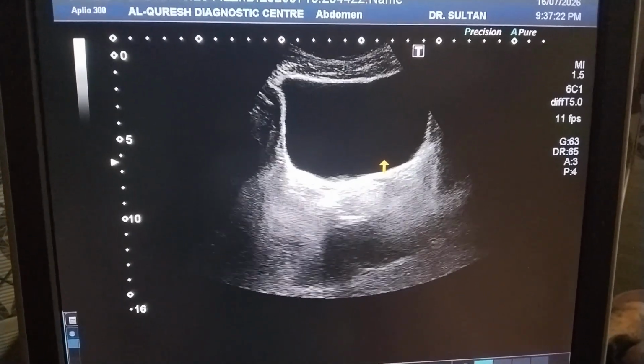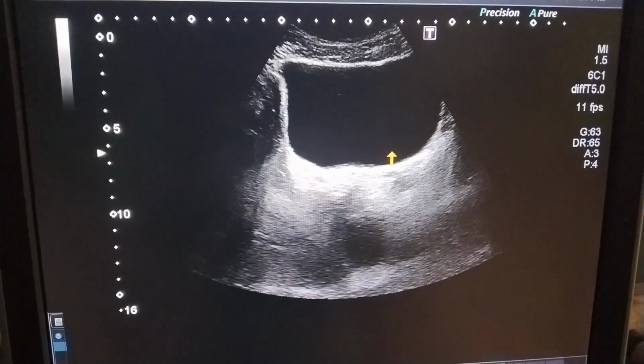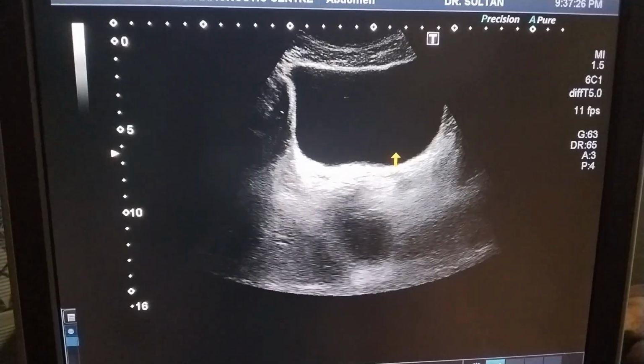So this was all about the normal anatomy of the urinary bladder.